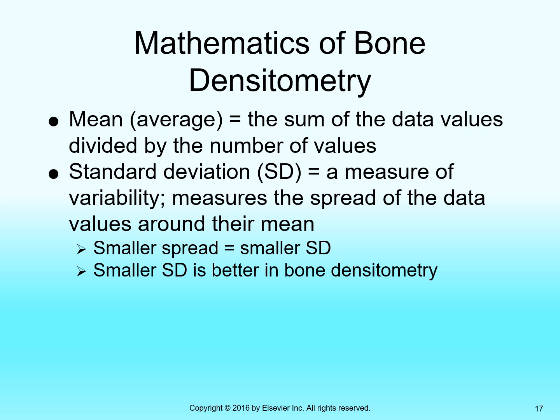But you can arrive at an average of 15 with the range not from 10 to 20, but from 0 to 30. You see, so the whole graph gets wider. It's still a symmetric distribution, still ends up with the same average, but now your scores are kind of all over the place, so to speak. Okay, so standard deviation is really telling you how much each individual measurement compares to the average. That is, how closely together are the individual measurements. So it gives you an idea of the precision of the machine.